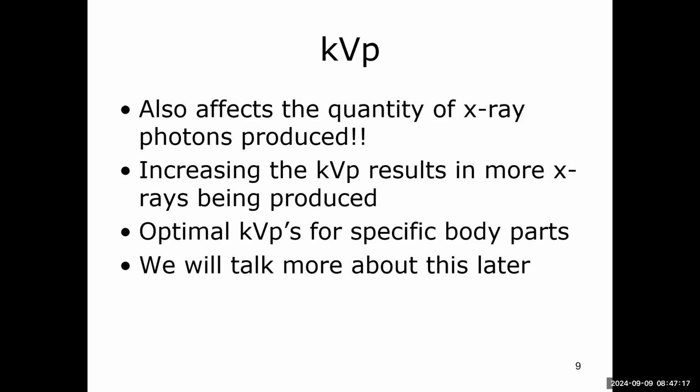mAs is a little different. You're going to see that those vary. It's going to vary depending on part thickness. It's going to vary depending on the type of equipment that you have. But kVps, we're going to learn ranges of those, and those will be pretty consistent.